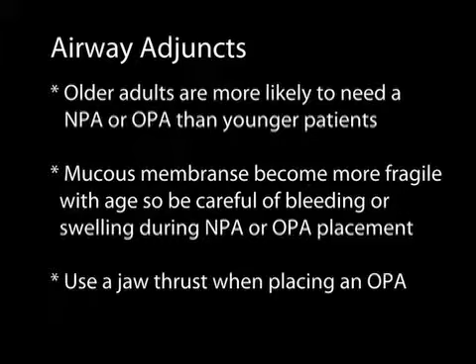Mucous membranes become more fragile with age, so be careful of bleeding or swelling during nasopharyngeal or oropharyngeal placement, and use a jaw thrust when placing an oropharyngeal airway.